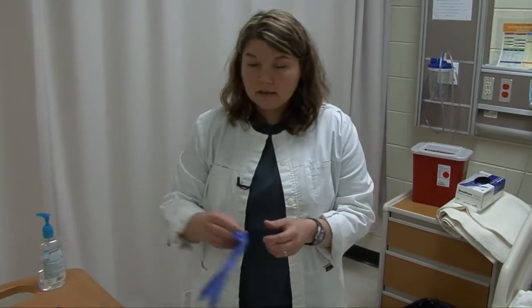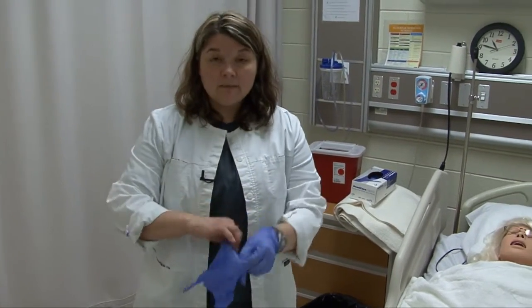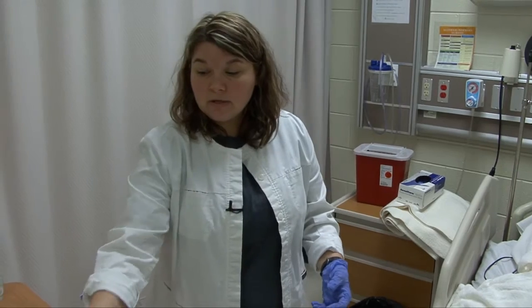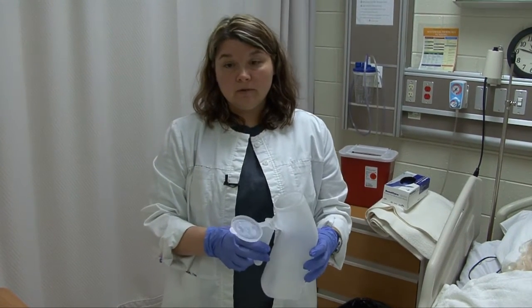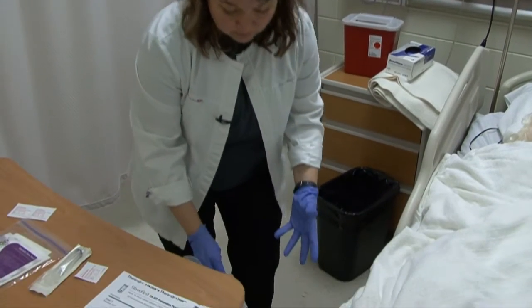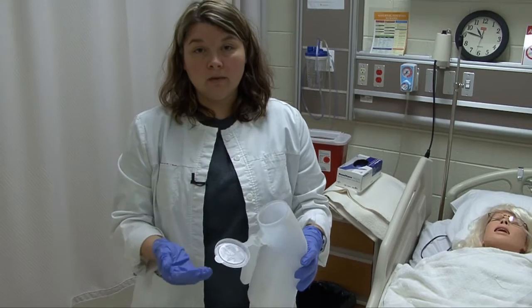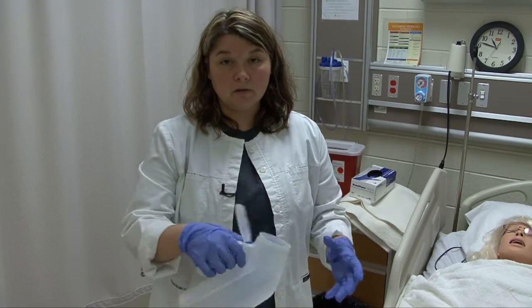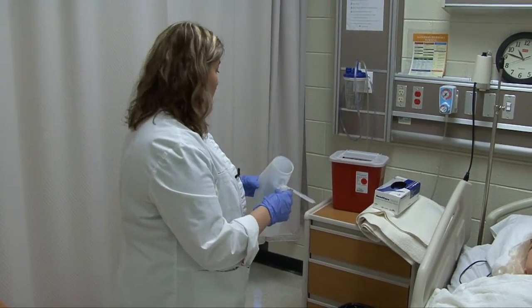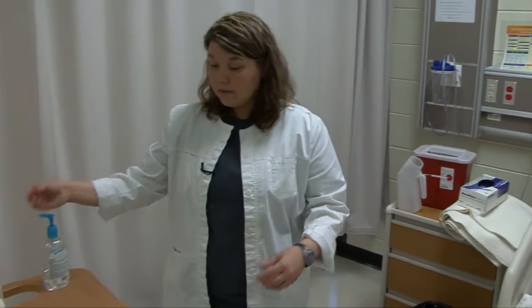The first thing I need to do is put on some gloves. After that, I'm going to empty the catheter, because you never want to discontinue a catheter with a full bag. I brought a urinal to empty the urine — I come down, make sure I don't touch the floor, and empty it. Once the urine is in the receptacle, I explain to her that I need to dispose of it. I leave the room, empty the urinal, take off my gloves, foam, and re-enter.